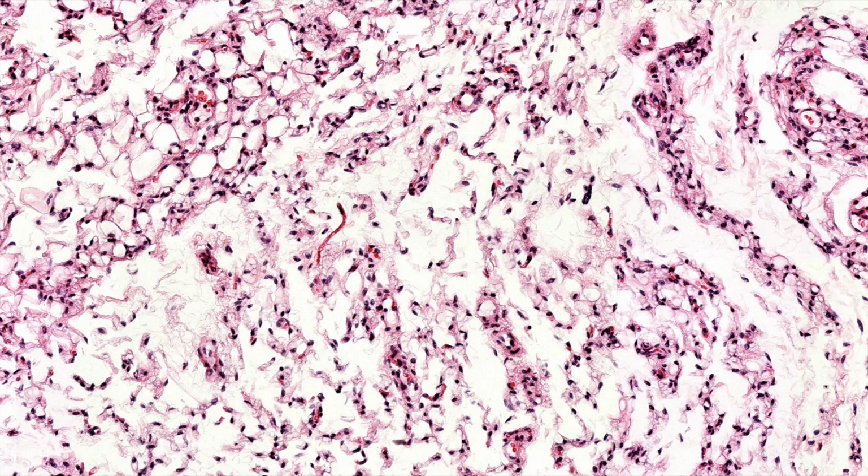The reason you can see them here is because as the fat cells shrink and the lipid gets used up and goes away, the cells get smaller, which means the nuclei that are always there get closer together and more dense. There are more nuclei in a given area of space on the slide. Same thing with the vessels. The vessels that are always there to transport lipid in and out of the adipocytes for fat storage and fat release when we need it for energy, right? That's why the fat is very richly vascularized, but they're really tiny vessels, right?